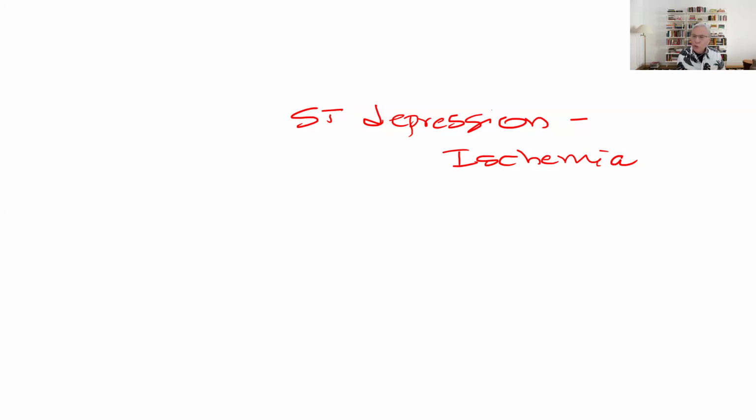So questions in the NCLEX might be, a patient is experiencing angina. You perform a 12-lead ECG. What will the nurse identify as an ECG change that would suggest the presence of myocardial ischemia? And the correct answer is ST depression.